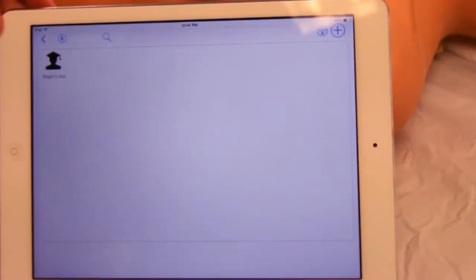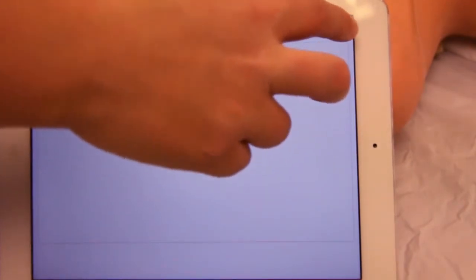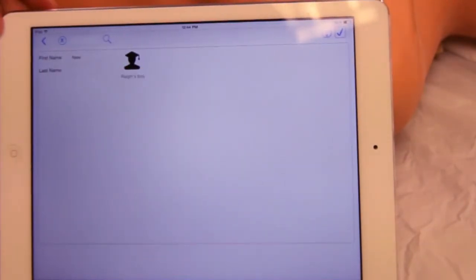Once settings are made, you need to establish at least one student. To add a student, tap the plus sign and fill in the information.